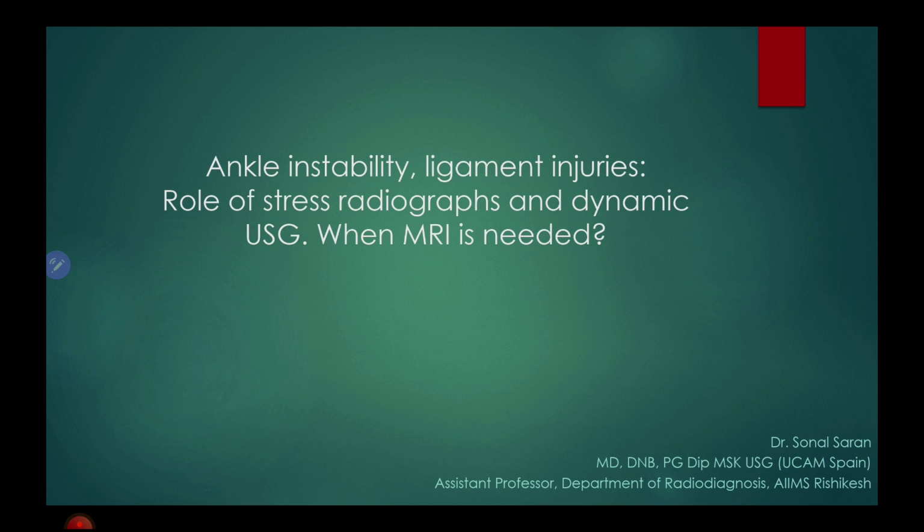The topic for my discussion today is ankle instability, focusing on ligamentous injuries. We will assess the role of stress radiographs and dynamic USG, and we will also see when MRI is needed.